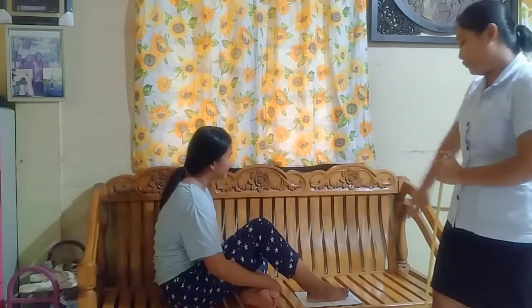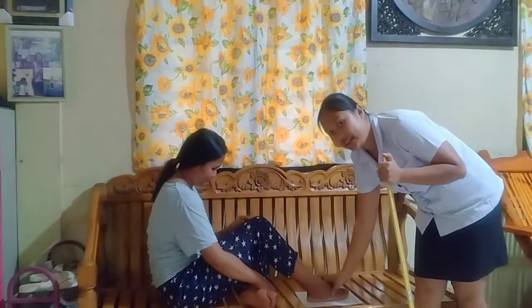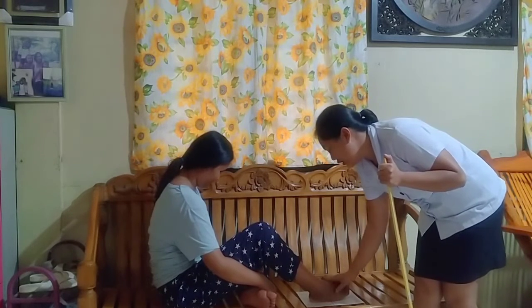Now, next projection, which is the opposite of medial rotation, is the lateral rotation of the foot. So, same position, the only difference is the rotation of the foot 30 degrees laterally in relation to the IR.